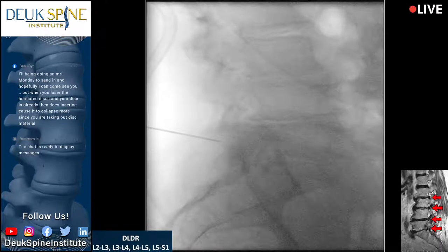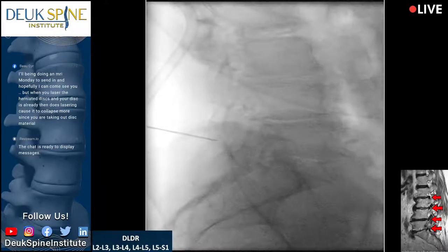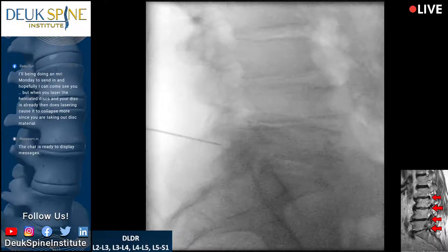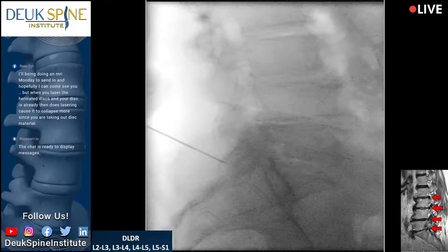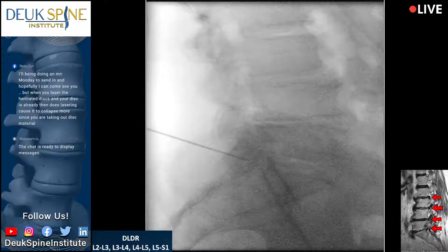Curve really far off there. You got to improve the quality of that picture. It's way overexposed. You're way off on the lateral, I think. Try to drop your side. I mean, go back to dropping your side. We're just off. Drop it more. We're off. I don't know if it's his moving. Drop it a little more. All right. That's probably right there going to be the best we're going to get. Shot. Shot. Shot. You awake? AP? Yes, yes. Good.